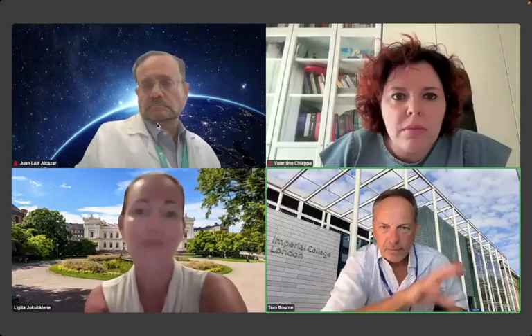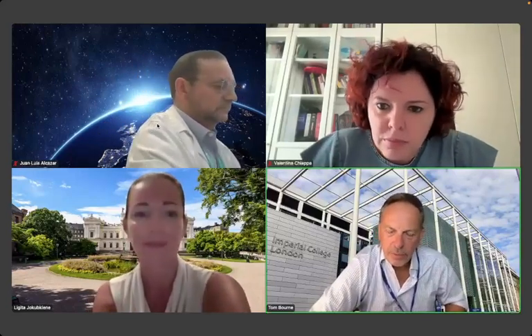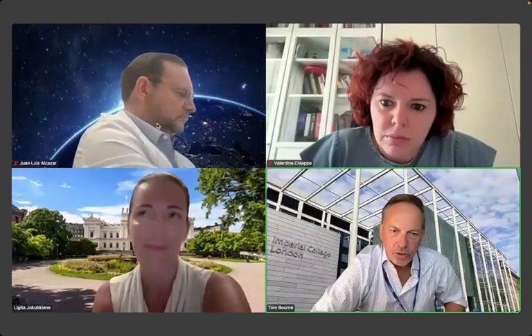I'm just interested. Obviously, you're describing an AI tool in effect, and this session is about latest innovations in gynecology. So, do you feel that for most users, how often do you have to correct it?